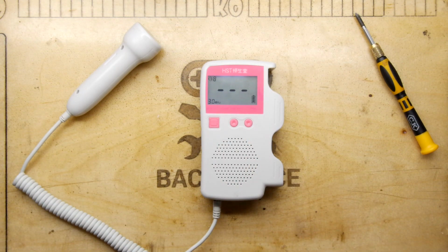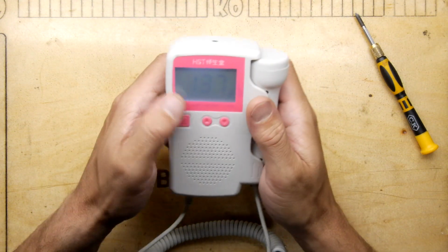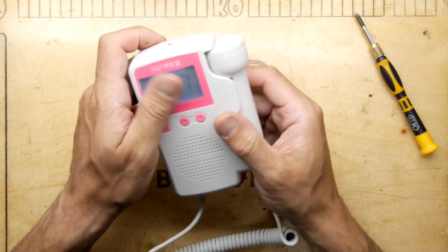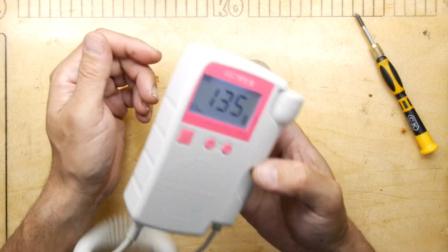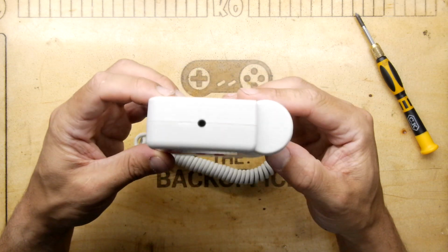It's a marvel. It really is. I mean, if you're a clinician or something, please comment down below, see if that's how it works. But for now, I think that's the fullest extent of the scientific analysis we do. We didn't really do any analysis on anything, but if you find one in a car boot sale for 50p, I would pick one up. It's definitely, well, I have.